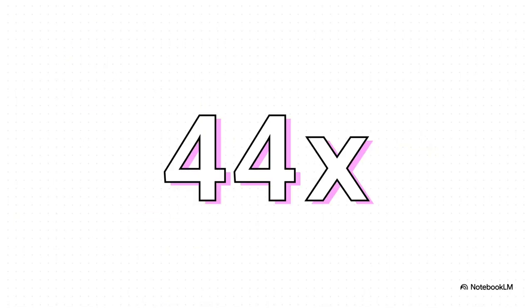And hey, if you need even more proof of just how committed the manufacturer is to safety, get this. The FDA has a standard for how much radiation is allowed to leak from a device. Well, the makers of Nomad hold themselves to an internal standard that is 44 times more stringent than what the government legally requires. 44 times!